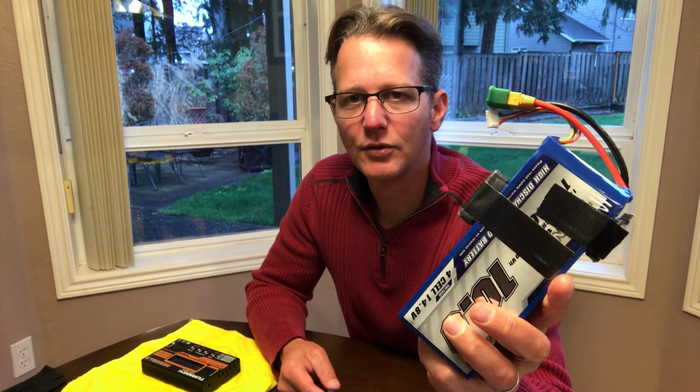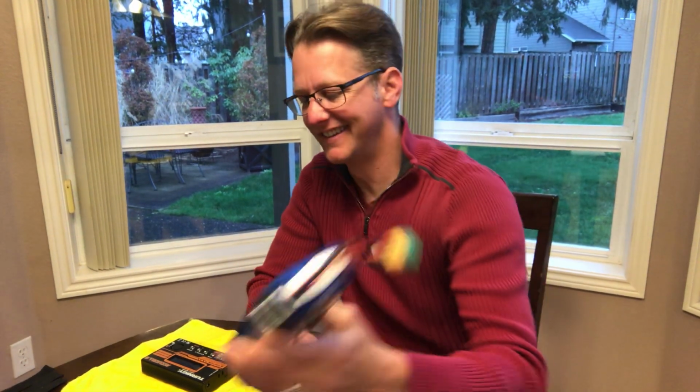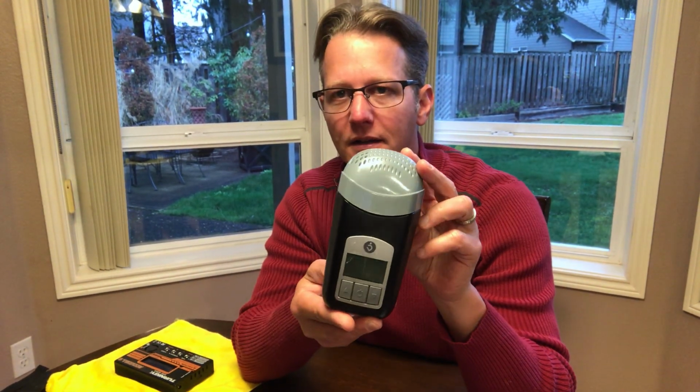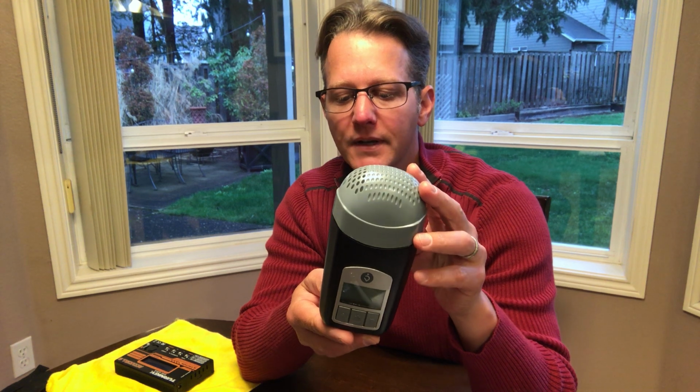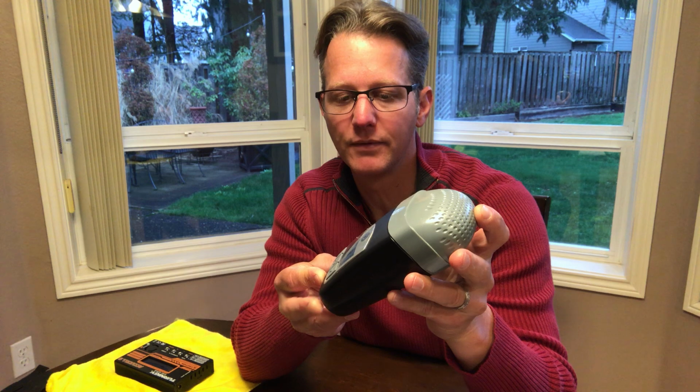So is it possible to do backpacking with sleep apnea? Absolutely. And this is the key. But I want to walk through this real quick and give you the overview. So I chose to buy this little mobile unit called the Z1. It is meant for running on car batteries at 12 volts.